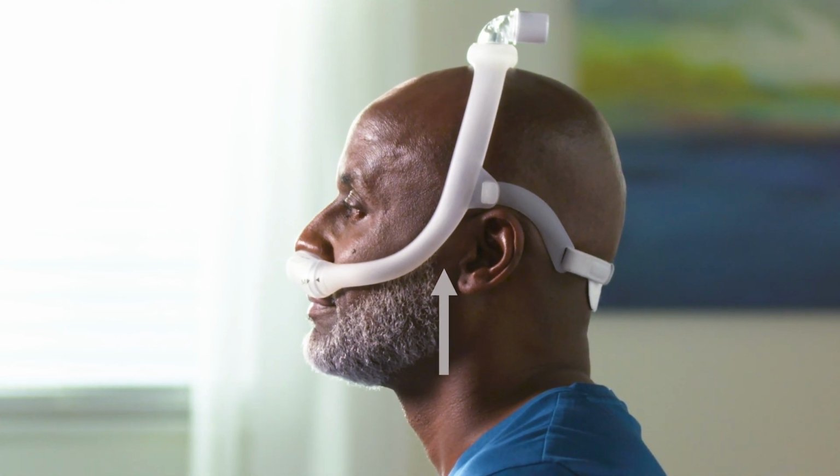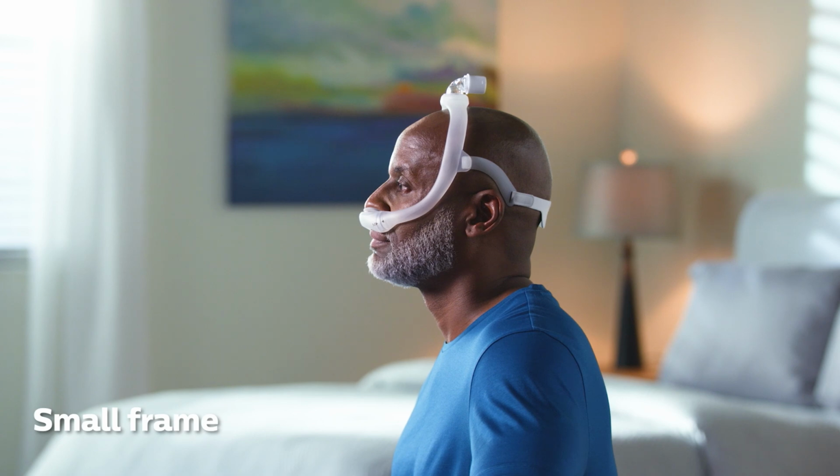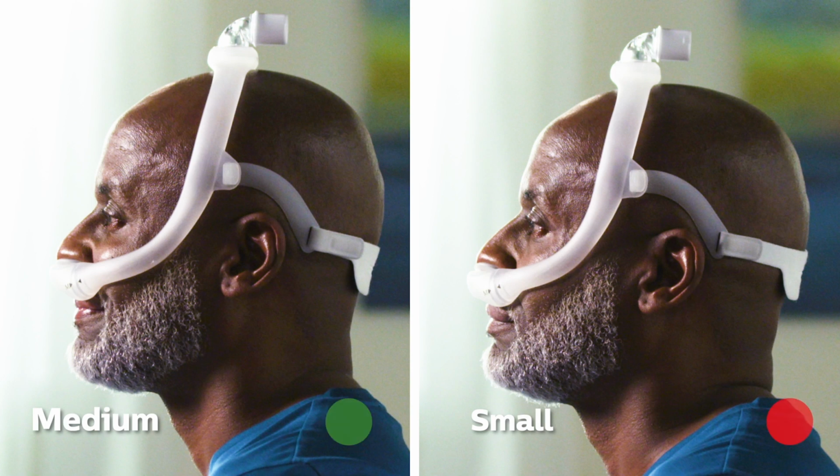a smaller mask frame. Notice how a properly fit medium frame compares to one that is too large. If the mask frame falls forward and is too close to your eyes, you may need a larger mask frame. You can see the difference in fit between a correctly sized frame compared to one that is too small.